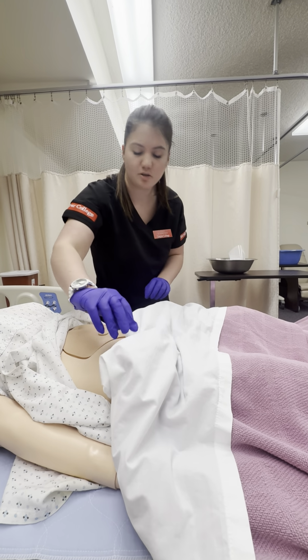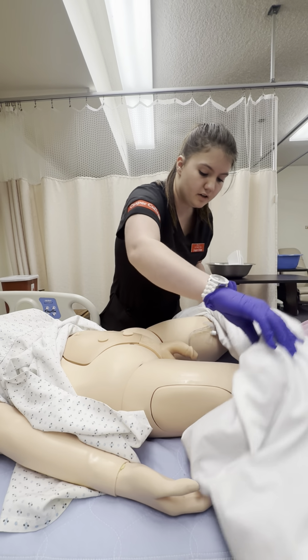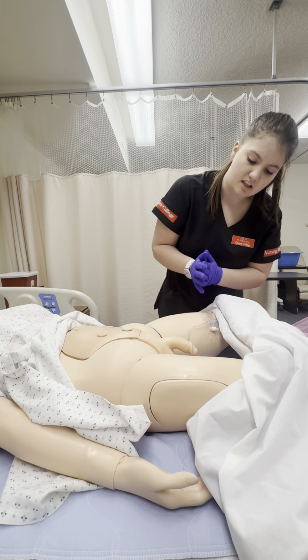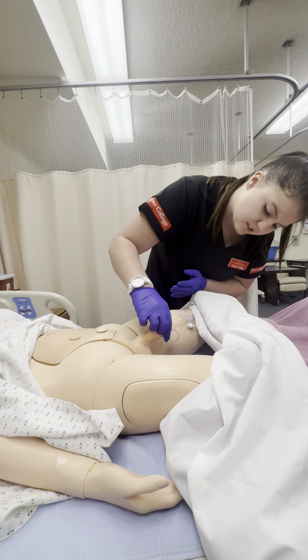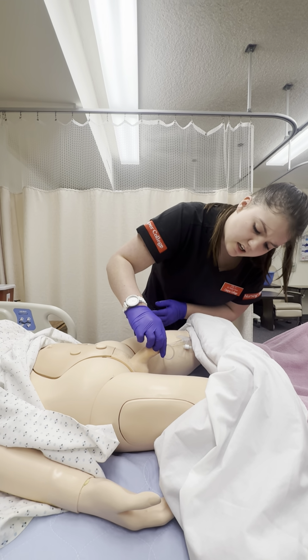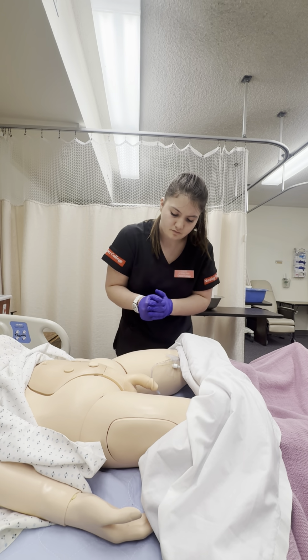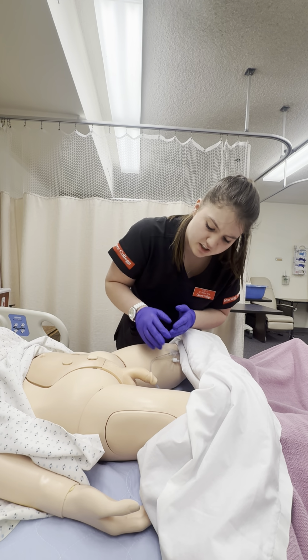I'm going to go ahead and perform a genital assessment really quick. Do you mind if I expose your genital region really quick? No, go ahead. Okay. From the external look, I'm not seeing any external signs of infection. I'm not seeing any discharge. I'm also going to lift up the meatus. I'm not noting any sort of irregular discharge, any bleeding, any irritation around the catheter insertion site. I'm not seeing any sort of moisture or pressure injuries in the genital region.